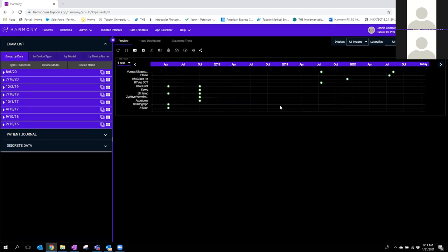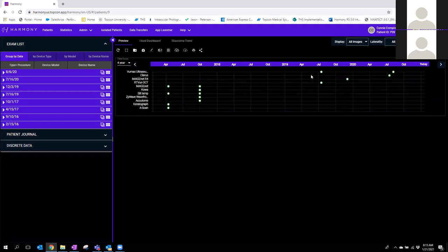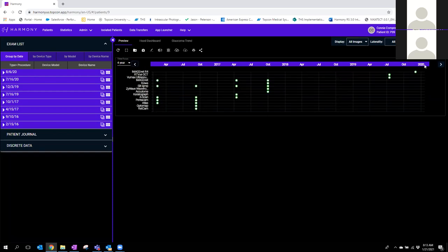What we have here are modalities — that's what these names are. They're customizable. If you're not really liking the name ImageNet, which is our fundus imaging software, we can change it to the word 'fundus.' These radial buttons represent actual dates on a four-year scale. You can hit these left and right arrow keys to pan across the timeline range. If you were looking at the 2019 year range, you can hover over a date and get the exact date — for example, a ViewMax ultrasound performed on July 16th.